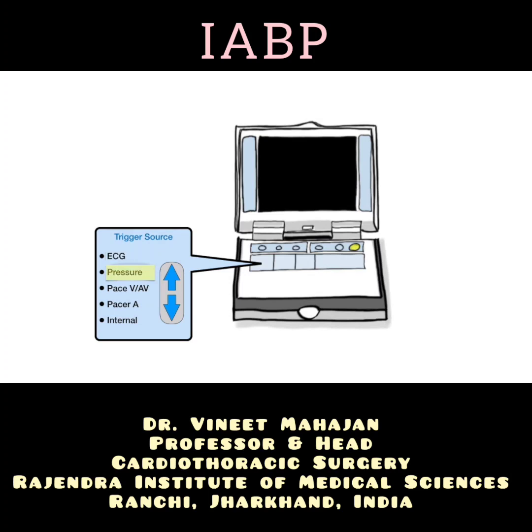Arterial pressure is a poor alternative because pressure waveform is always slower than electrical waveform. It uses a systolic upstroke of the arterial waveform to trigger deflation. Pacer VAV uses the ventricular pacer spike in V or AV paced rhythms to deflate the balloon. Remember, when 100% paced, there is no reliable R wave. Pacer A uses the R wave to trigger deflation. Internal defaults balloon inflation to 80 beats per minute and is used only during cardiac arrest, never used in a patient generating their own cardiac output.